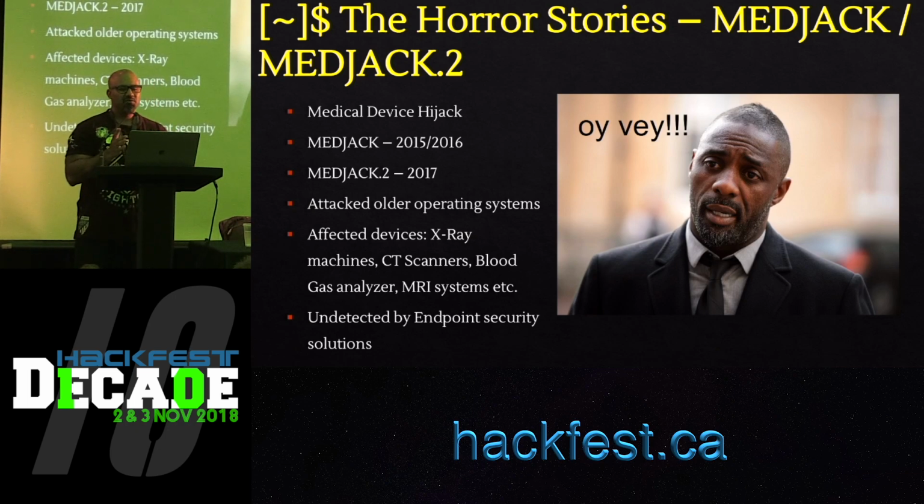One of the tricky things about Medjack was that it went almost undetected by endpoint security solutions. The reason was that Medjack specifically targeted older operating systems and older vulnerabilities, like Windows XP, 2000, and 2003, and vulnerabilities like MS08-067. Why did it go undetected?